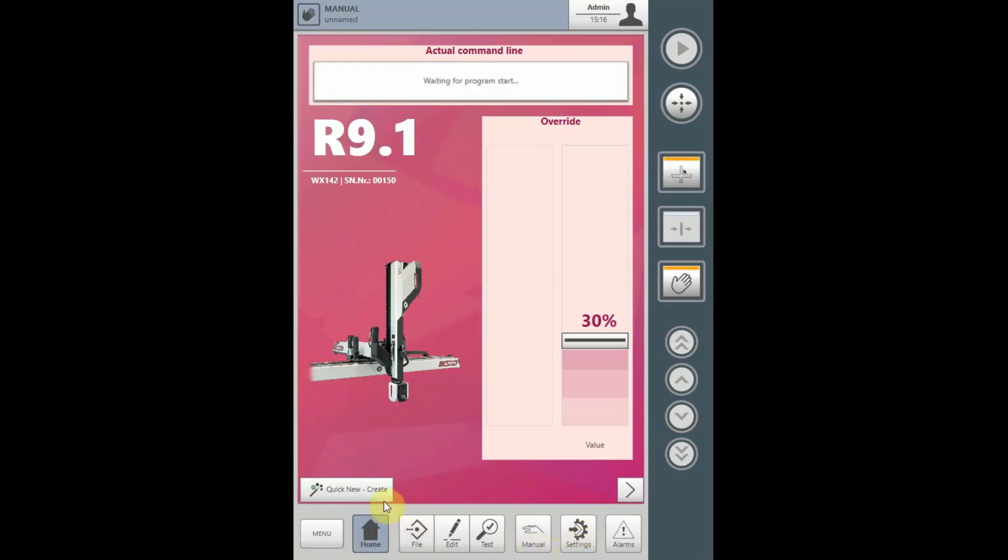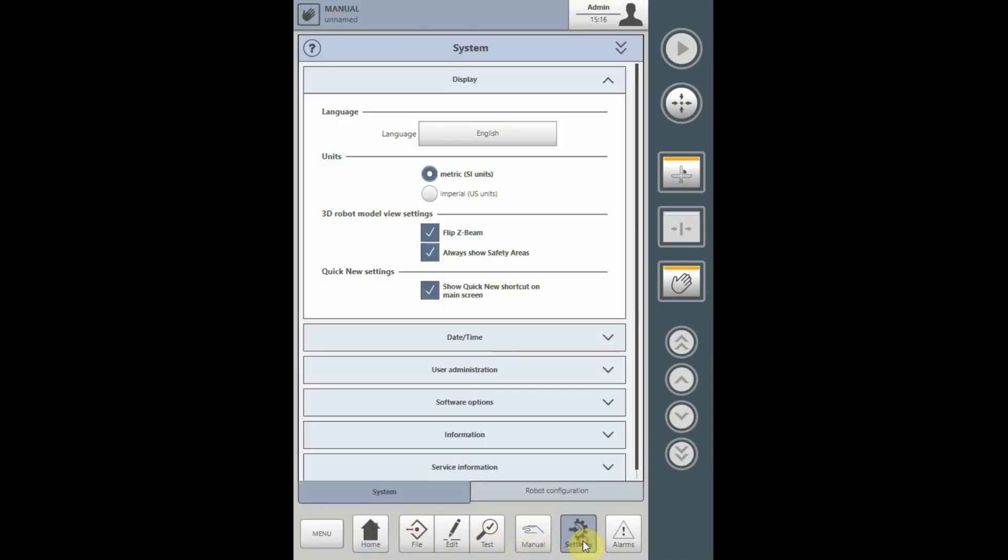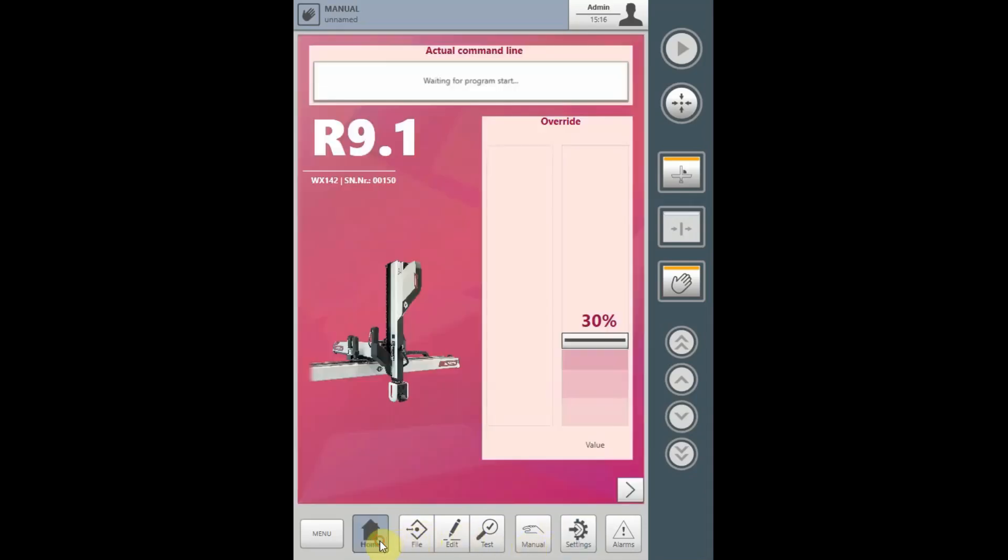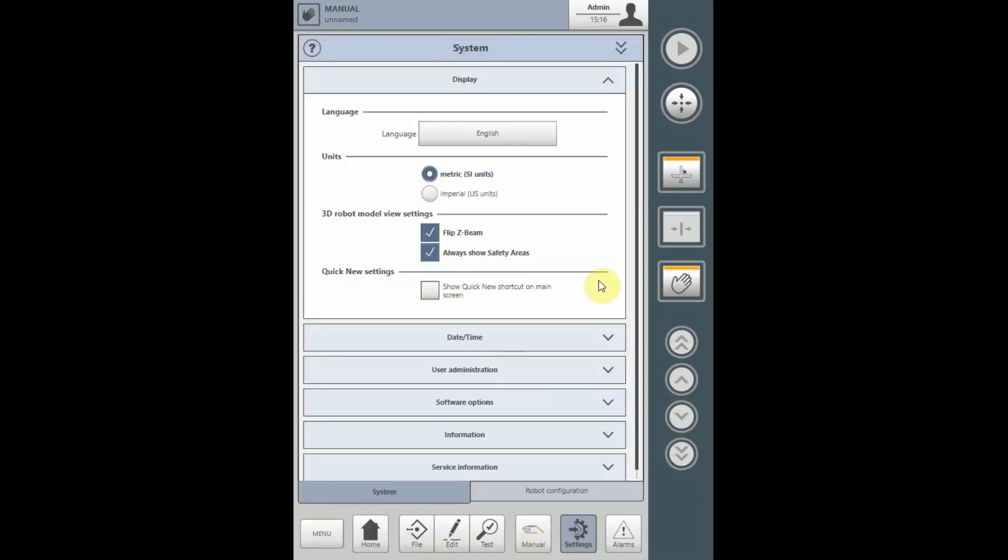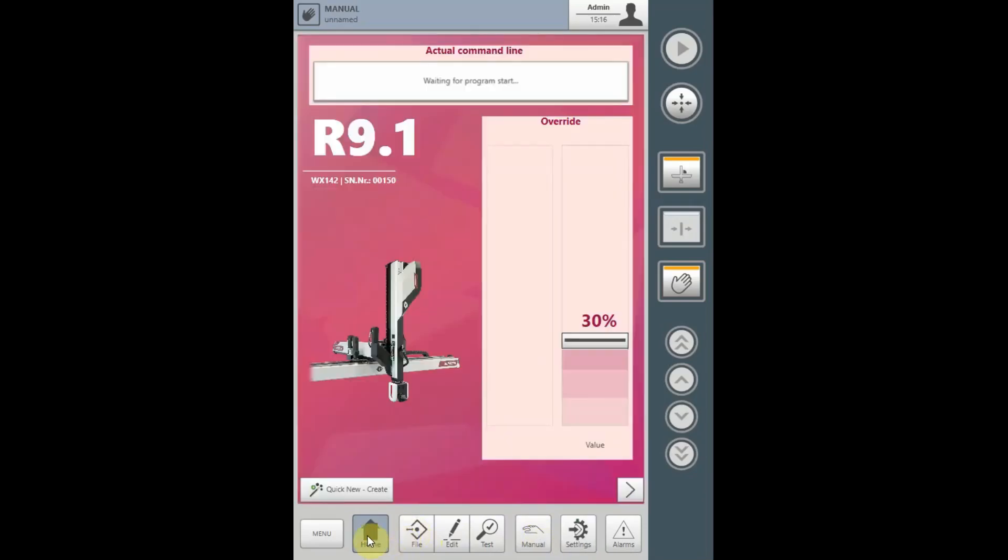To remove this button, under Settings, turn off Show Quick New Shortcut on Main Screen. When you return to the home screen, the button has disappeared. To restore it, go to Settings, Display, and check the box for Show Quick New Shortcut, and it will reappear.